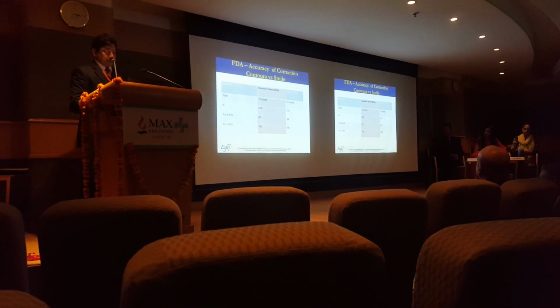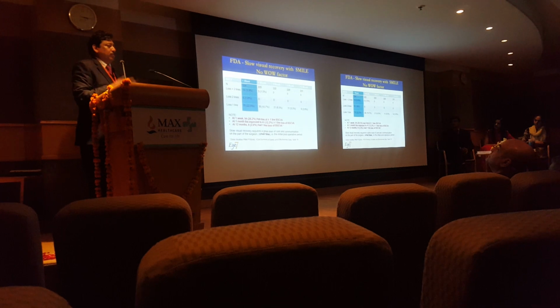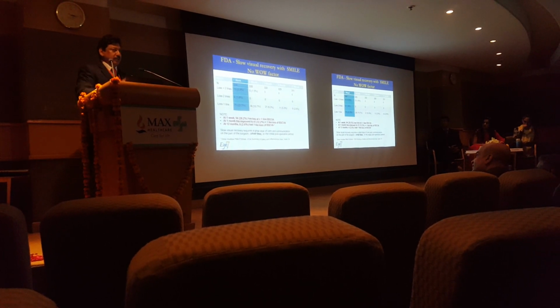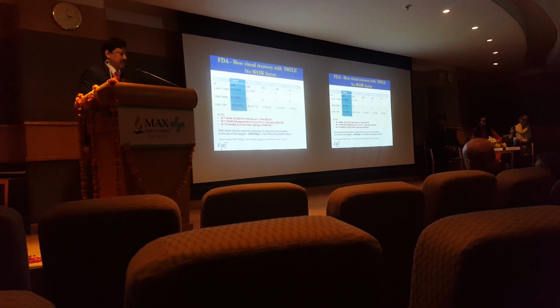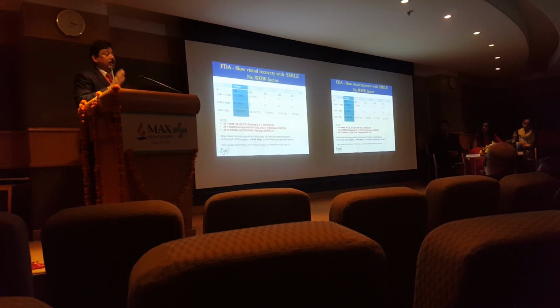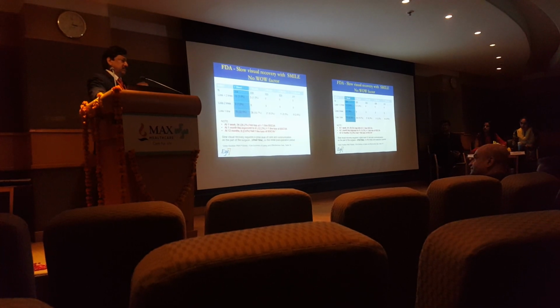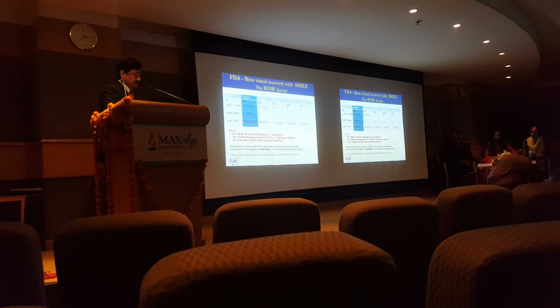Okay, now let's see about visual recovery. We know there is no wow factor in SMILE. That even the SMILE users say, that the vision is not clear for the first 1, 2, 3 days and then it starts clearing up. Whereas LASIK is instant. You do it and within half an hour the patient has a vision of 6/9. Okay, let's leave the 3 days. Let's go to a week later and let's see what FDA says in 1 week's visual recovery.